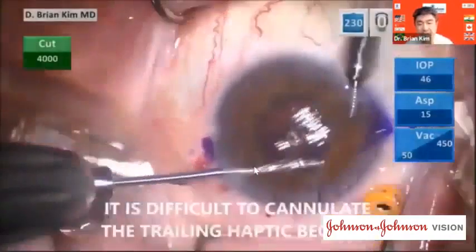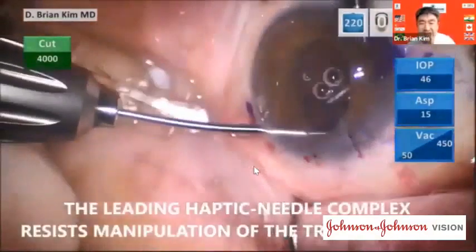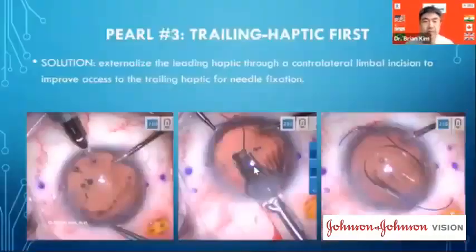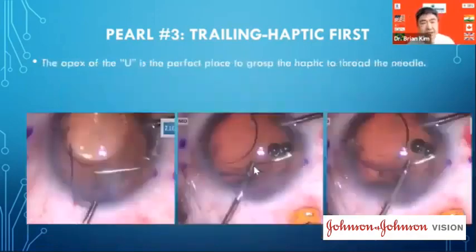And so you can see how this is illustrated here. It's difficult to cannulate the trailing haptic because the leading haptic needle complex resists manipulation of the trailing haptic. The solution is to externalize the leading haptic through a contralateral limbal incision to improve access to the trailing haptic for needle fixation. Pearl 3B is to place the trailing haptic within the incision in a U-shaped configuration. And the apex of the U happens to be the perfect place to grasp the haptic to thread the needle.